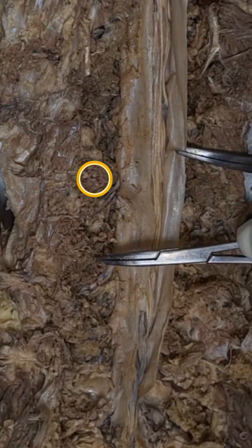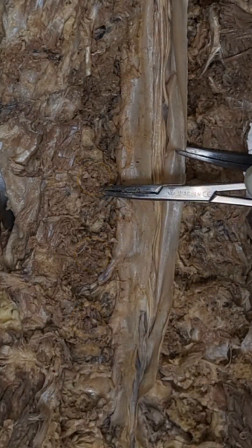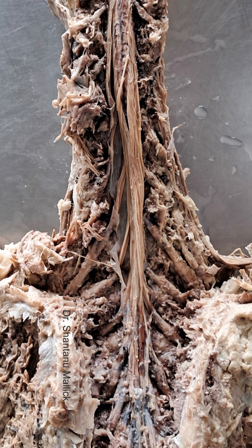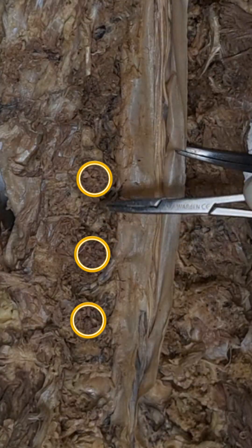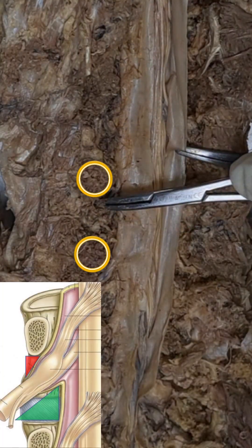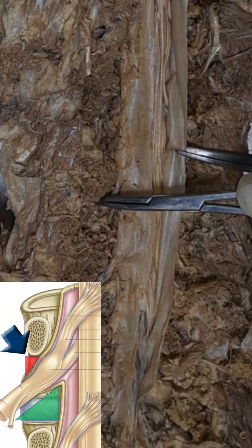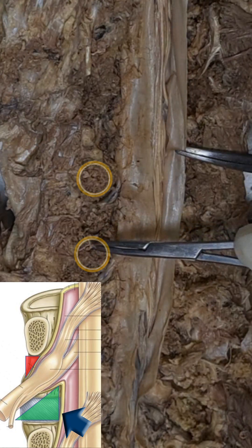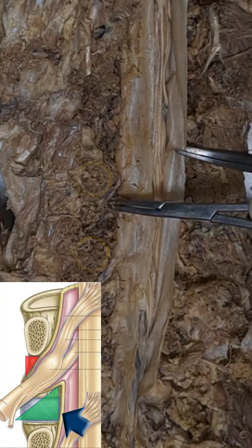This is the concept of dorsal ganglion RF. Looking at the position of the dorsal ganglion: here is one pedicle, here is one foramen. The dorsal ganglion is just inside the foramen but sits at a slightly upper level. That is why when thinking about transforaminal epidural at the subpedicular level, the space there is less. For Kambin's triangle — with the pedicle here — the dorsal ganglion is a little up, giving more space. You can see the triangle.